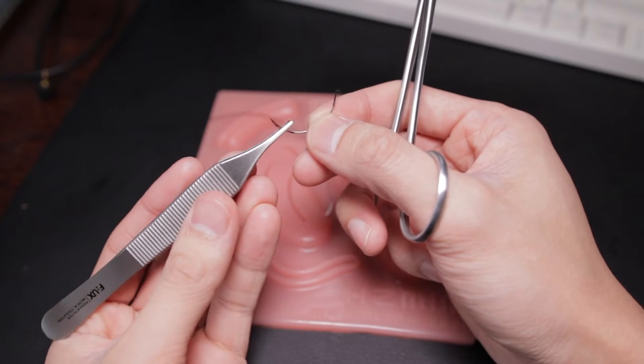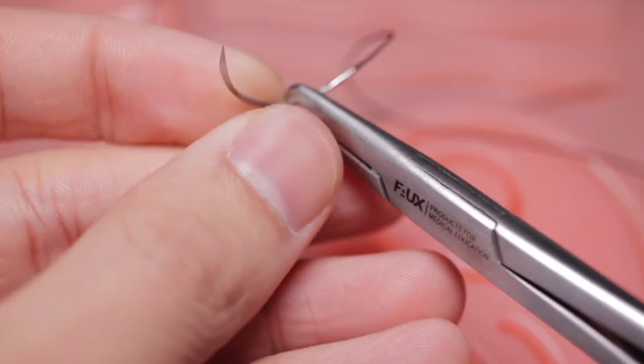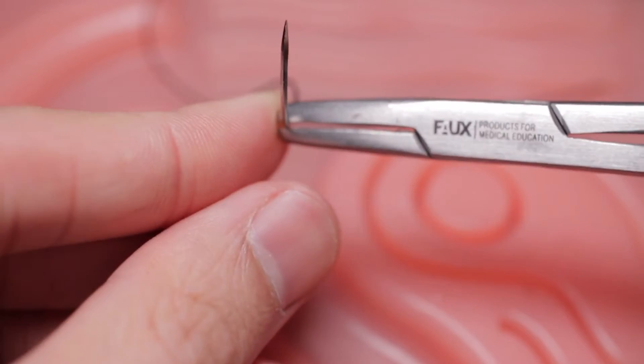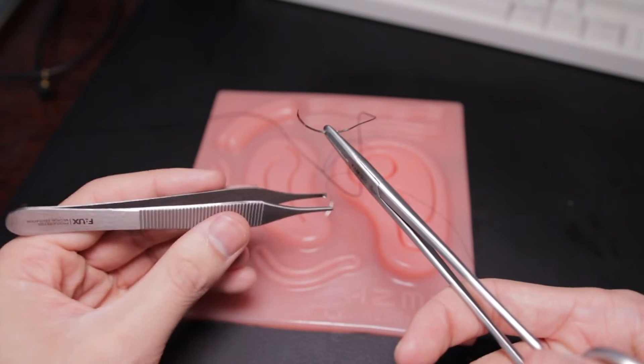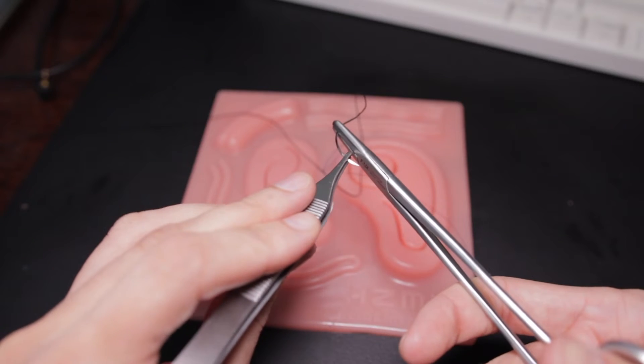Once you're comfortable holding these instruments and locking and unlocking the driver, you're going to take your needle. I recommend starting with a bigger needle so that it's easier. When positioning the needle on the needle driver, you want it at around 90 degrees, about two-thirds of the way down the needle. It's going to be really tempting to hold the needle with your fingers, but it's important to get used to using your forceps to handle the needle to avoid sticking yourself. The next exercise is positioning the needle — loading it into position using the forceps. The forceps aren't really designed to hold the needle, but it's possible if you jam it at the end in the teeth.